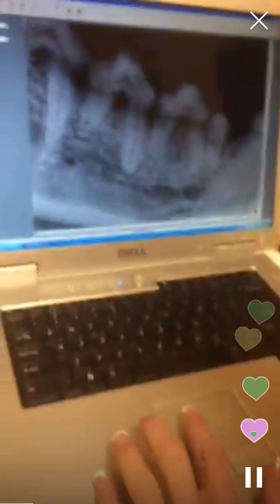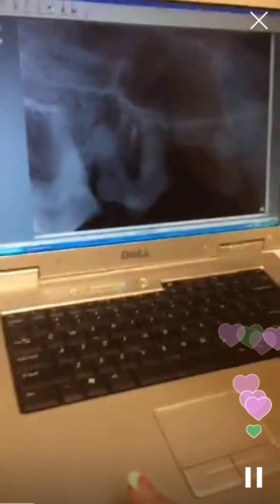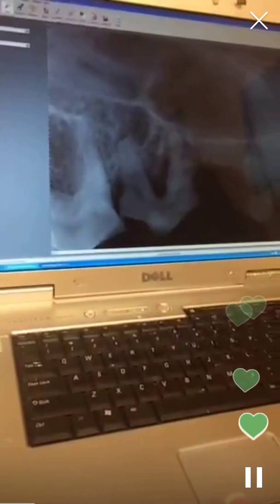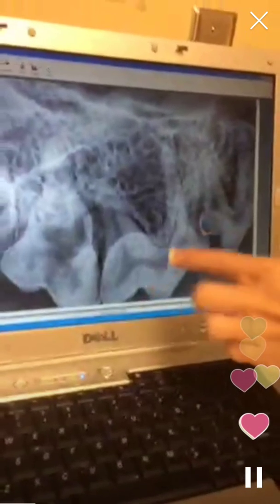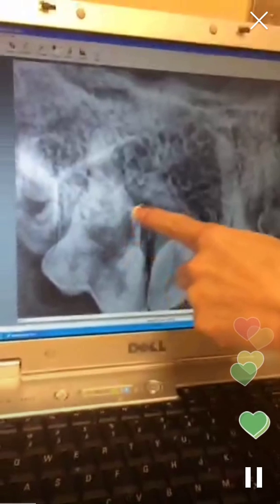And we're actually turned around. That's this one on the wrong side here. So that is the 3rd premolar. Get the 4th. There we go. And then it's hard to see on this x-ray, but this is where the gum tissue was completely missing. So this black area here is actually abscess.